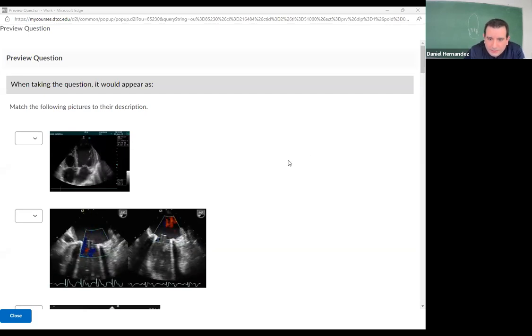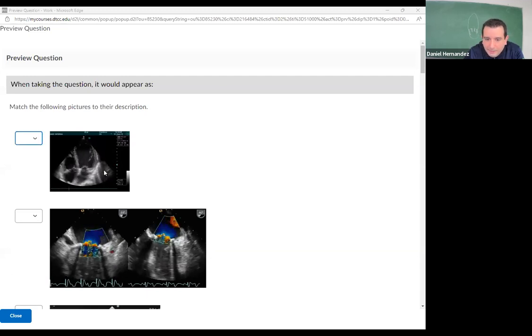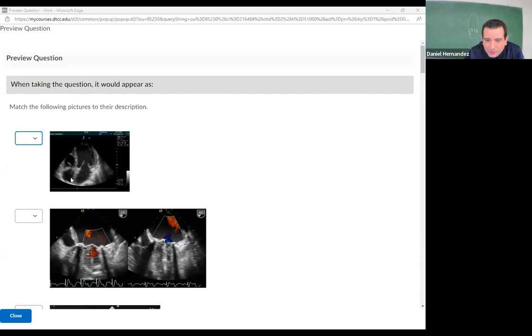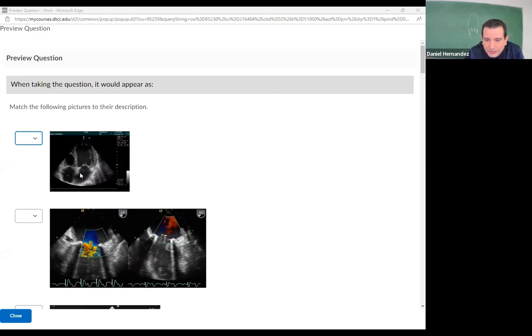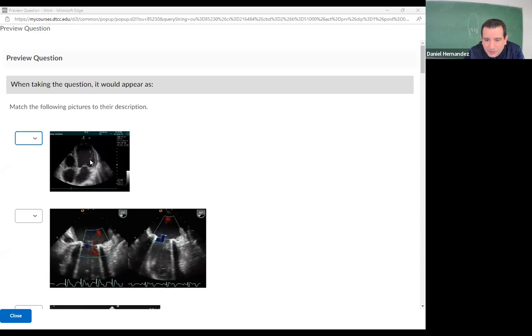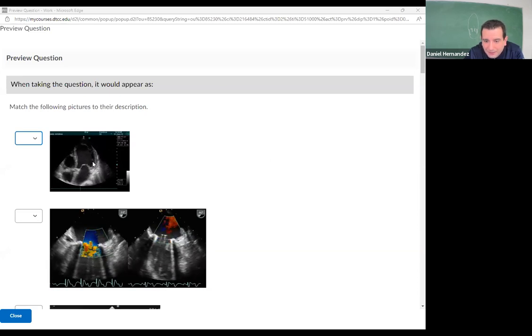All right. So just going through these clips again. This first one, I tried to show a picture of a patient that had an infarcted wall segment. The best way to look at an LV to determine which wall segment's infarcted is to not only focus on the motion, if it's contracting, but to see if it's thickening. So I can see thickening of the myocardium along this.